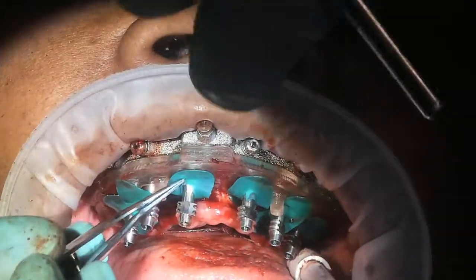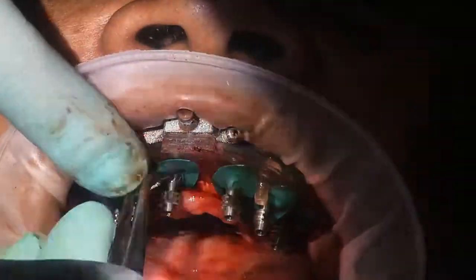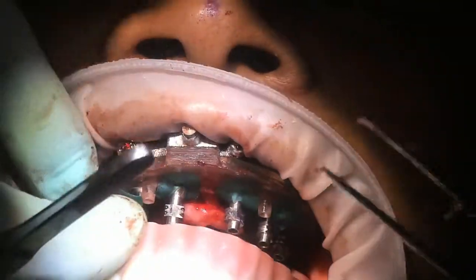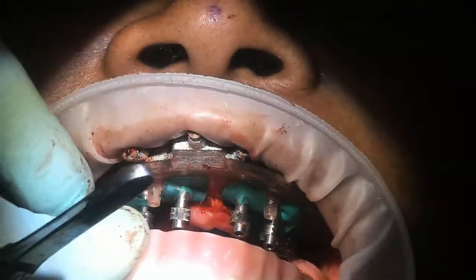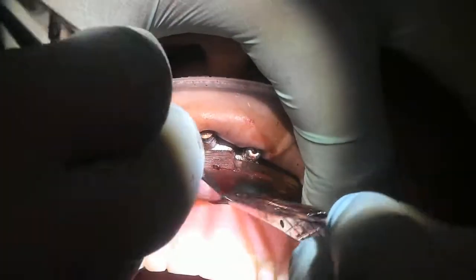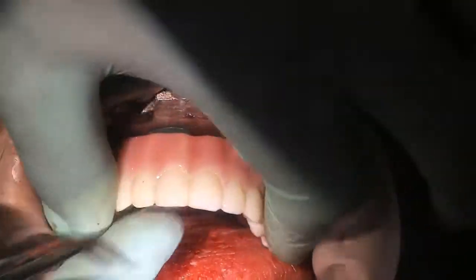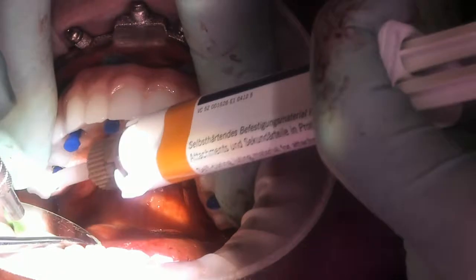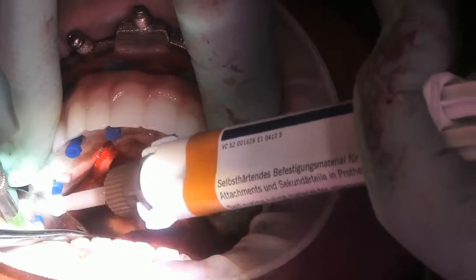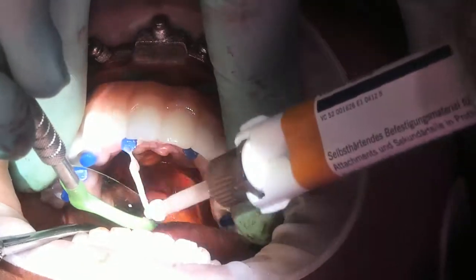And they are all tightened down, and the green gaskets are used to block out the carrier guide, and the prosthetic is inserted, and the prosthetic conversion begins. Once the prosthetic is fully seated onto the carrier guide and there's no rock or gap, adjust as needed, then the small blue blockout plugs are placed in each cylinder, and then the Voco or other material, we really only recommend Voco or perhaps Stellar, they're both used to pick up the prosthetic.